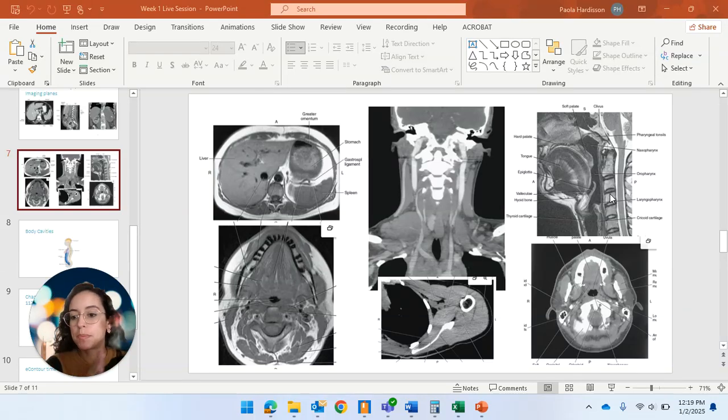So the purpose of this video is to teach you the way that shifts are calculated and what we mean when we're talking about which direction we can go if we use this image. As a radiation therapist, you're going to be looking at images all day, comparing what position the patient should be in versus the position they're in today. And you're going to have to shift today's position to match what was previously calculated.